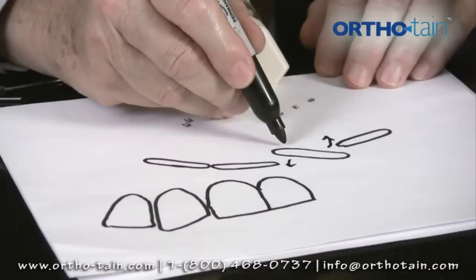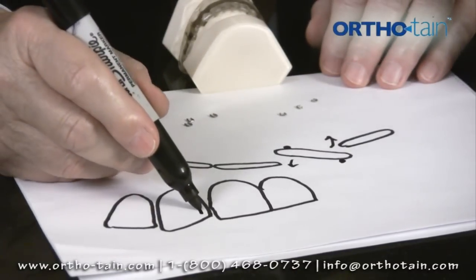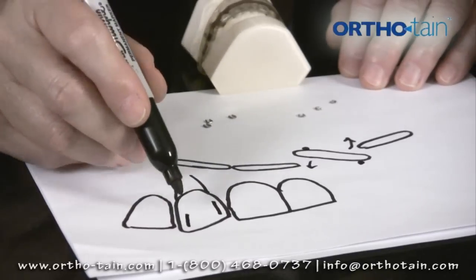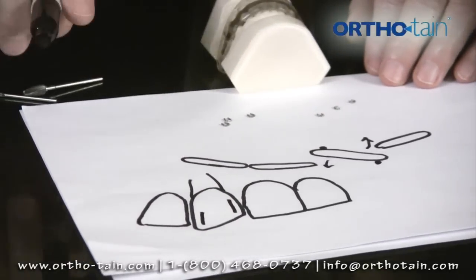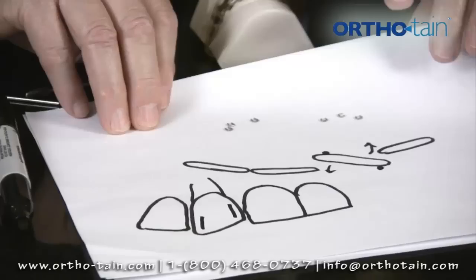So we would put a cleat right there, and we'd put another cleat right there. When we put that cleat on, it's along the long axis of the tooth. And if we wanted to put a cleat here, we would put it along the long axis of that tooth. So we're going to put a cleat in this model for you, but first I will show you another technique.